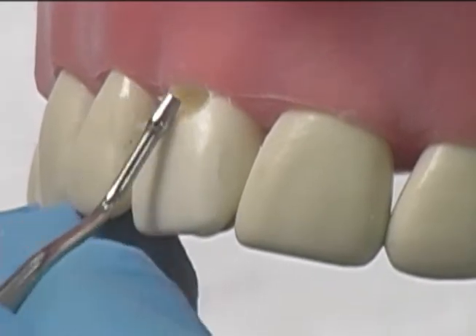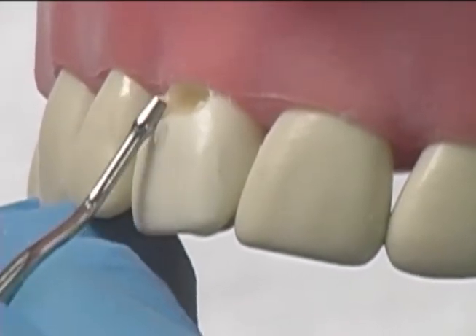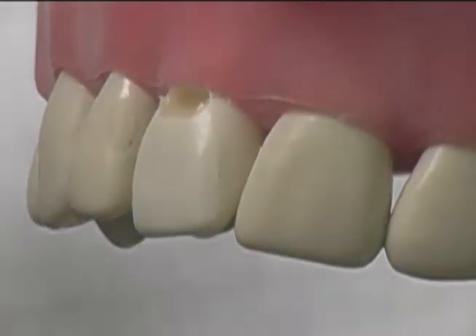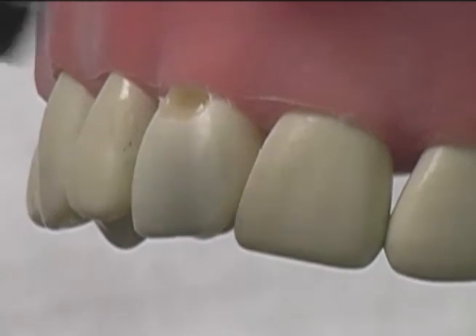We can use a wiping motion to take away excess at the incisal area of the preparation, and then cure our first layer.